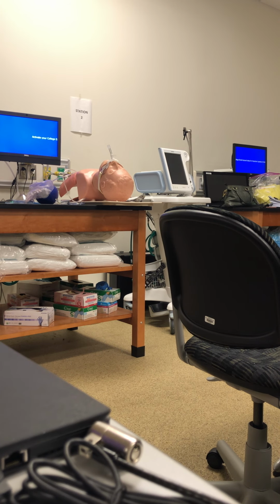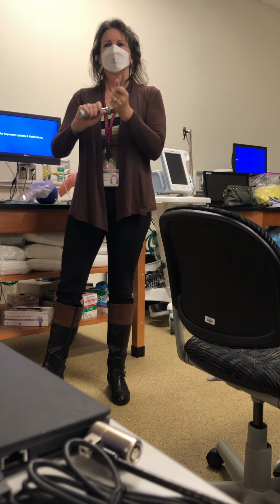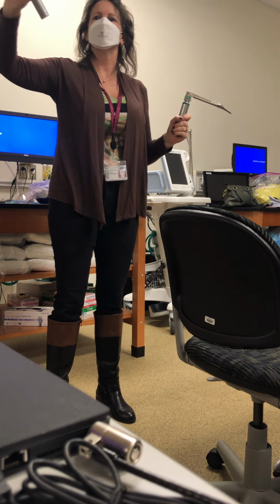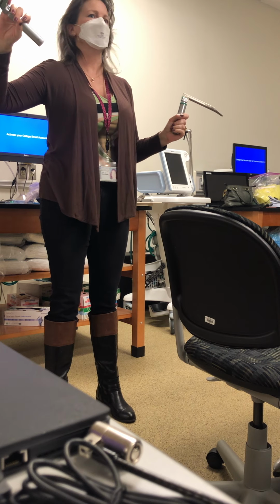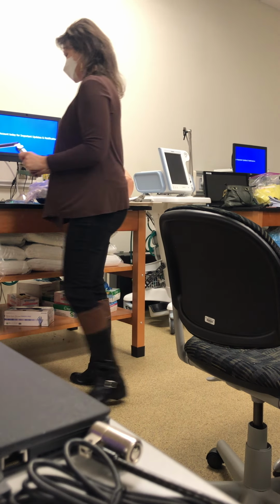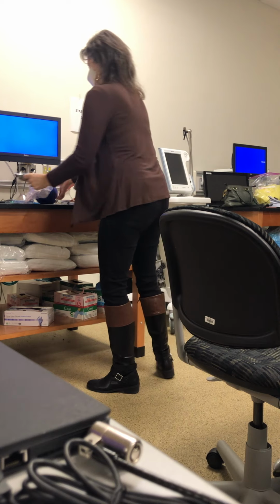So what is the straight blade called? Miller. What is the curved blade called? Macintosh, good. In your PowerPoint, if they ask what size we're going to be using, what size are you going to say? A 3. A 3. Okay? So, if we're going to be intubating this guy, we're going to pretend like we're going to intubate.